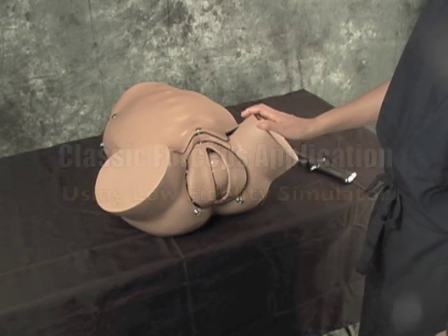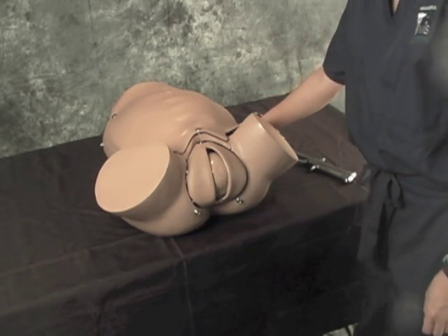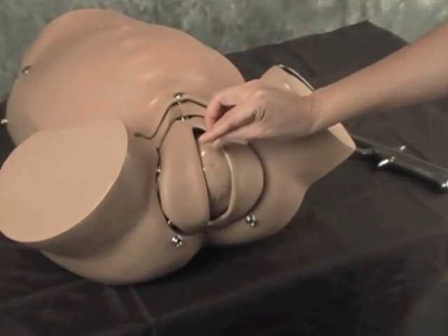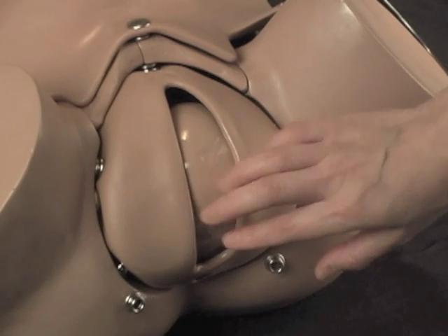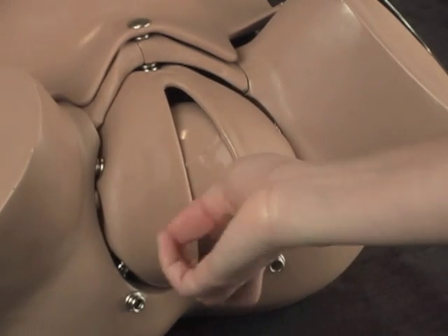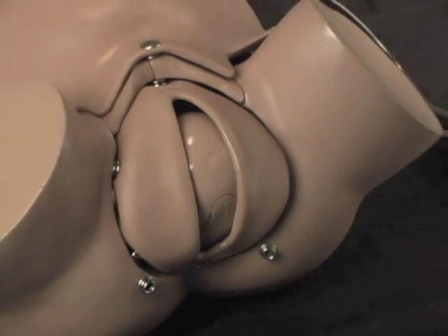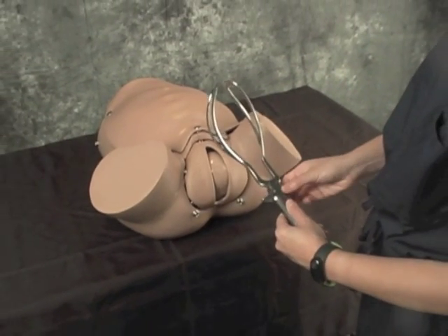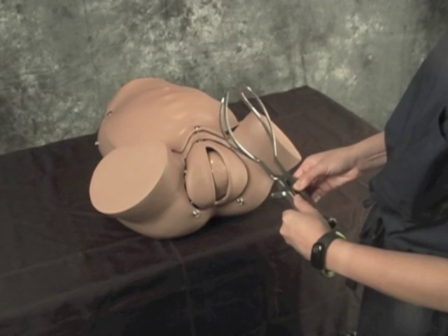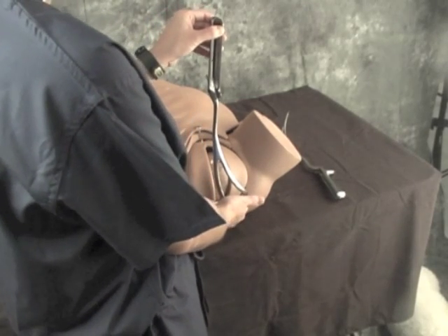Place the patient in a lithotomy position and ensure adequate anesthesia. Completely empty the patient's bladder. Check the sutures and fontanelles to accurately diagnose fetal head position. Hold the forceps in a locked position with the pelvic curve up, directed in the position they will be applied to the fetal head. In a straight occiput anterior position, the left blade held by the left hand is applied first.